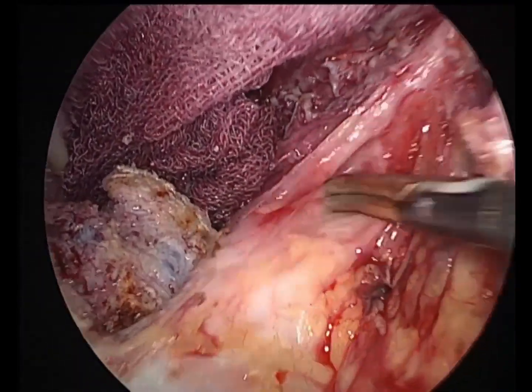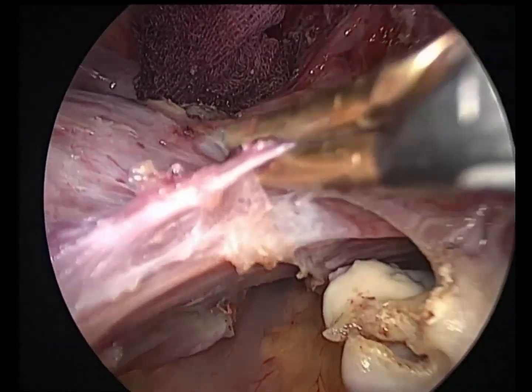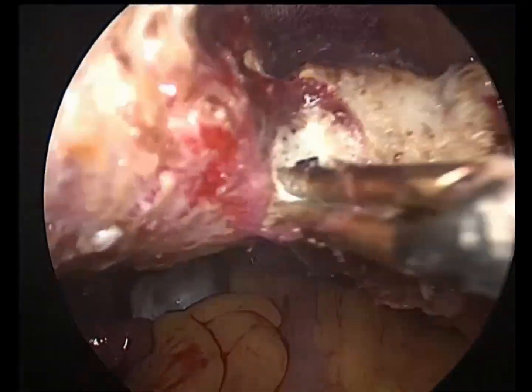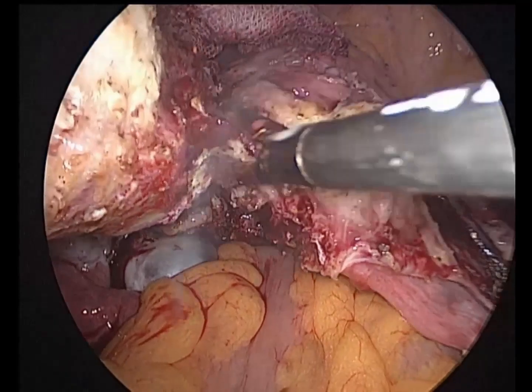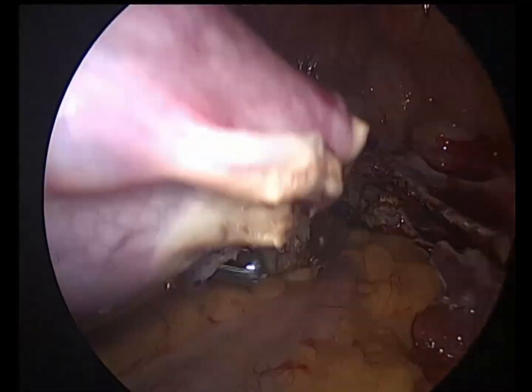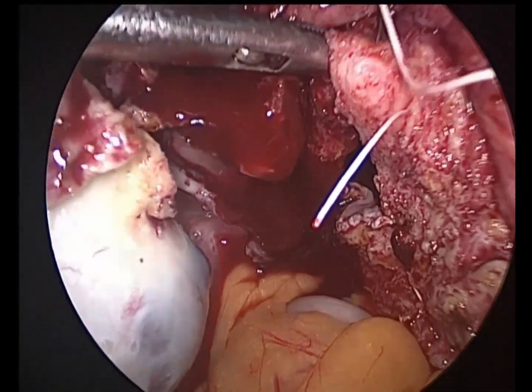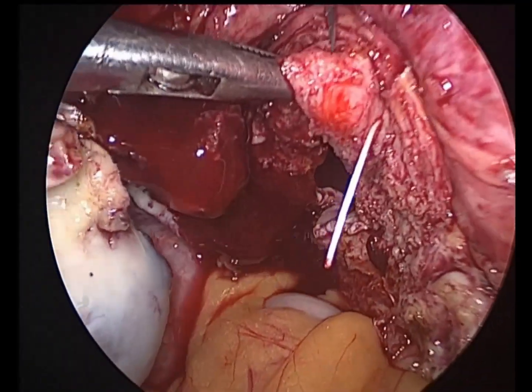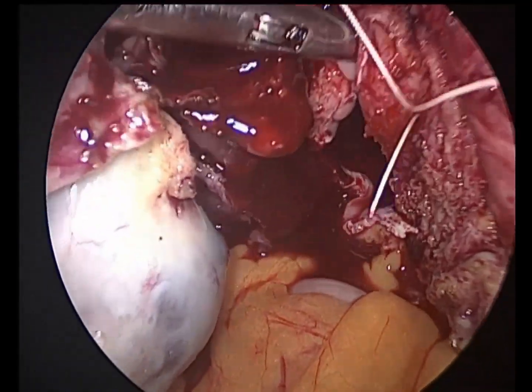After separating, coagulating and dividing the uterine pedicle, now the uterus is free from the vault. We will check hemostasis, suture the vault, take 2 sutures, very good bites on the right edge and the left edge for better hemostasis.